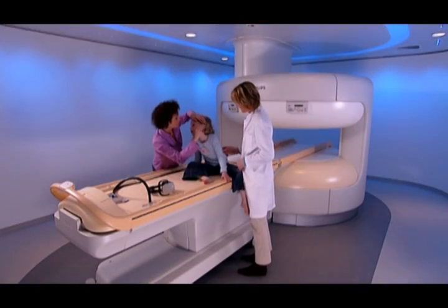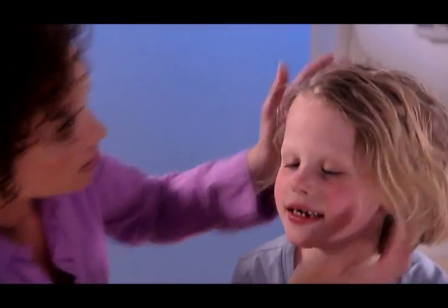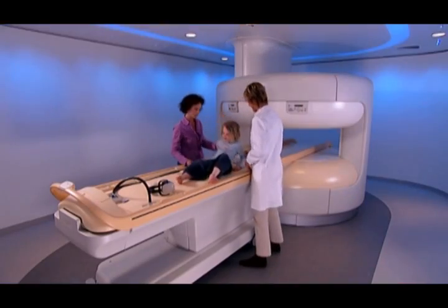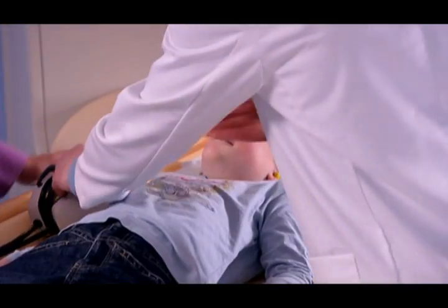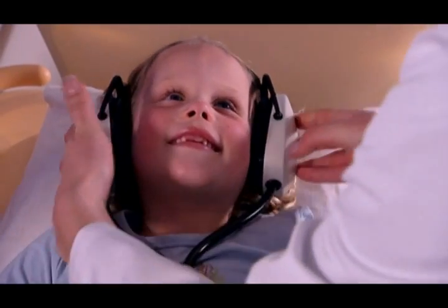Earplugs are not always effective for all patients. Positioning of the plugs in the ear is a tedious job. Headsets can also be applied incorrectly, and in the case of children and babies, this can become a practical problem.